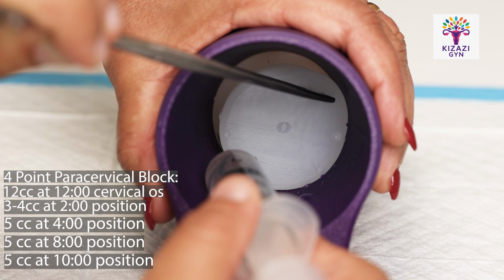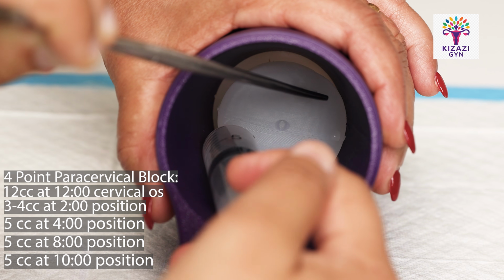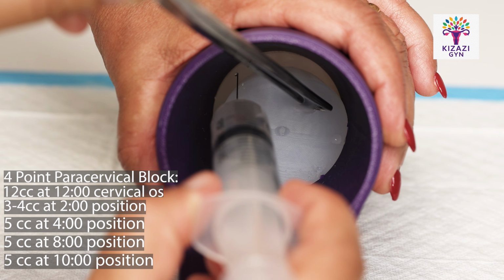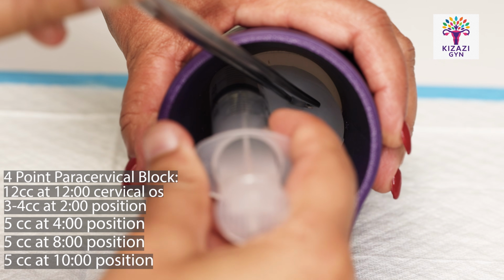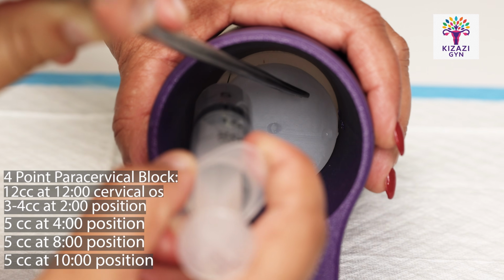You're going to find the 8 o'clock position, inject 1 to 3 centimeters, aspirate, then you're going to inject, pull that needle out, and then lastly, you're going to inject at the 10 o'clock position, aspirate, and then inject the rest of the lidocaine here. And then you're going to come out.